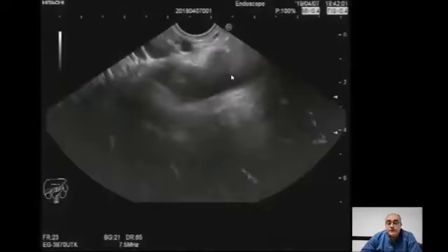And then after visualizing the main abdominal aorta and its first big branch, which is the celiac axis, and its bifurcation into its three main branches, left gastric, splenic, and common hepatic, and the common hepatic gives its two main branches, gastroduodenal artery and the hepatic artery proper.